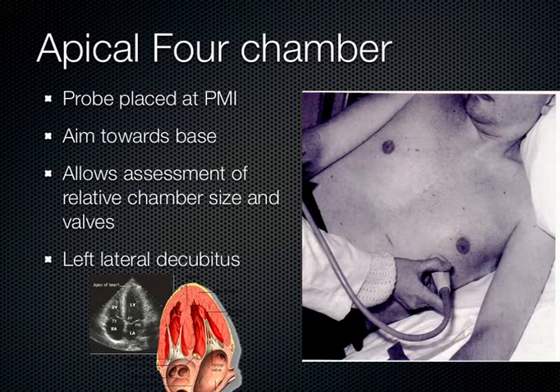Now patients who have chronic obstructive pulmonary disease or who smoke a lot, they lose that PMI, it goes away because their lungs expand to fill that little space. So this is a very difficult window to obtain in patients who smoke or have chronic obstructive pulmonary disease, or COPD. But this next week with your models, you'll see none of them do that. They all have really good PMIs, and so this is a pretty easy window to get, hopefully, next week.